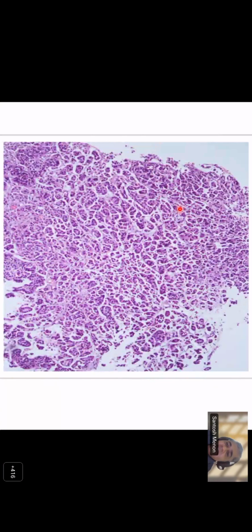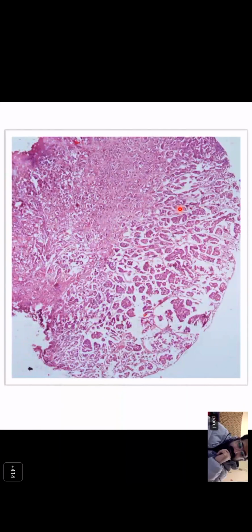Fine. So Jayshree, you want to say more about this? Sir, I could see micropapillary architecture. So you call them micropapillary? How is a papillary different from a micropapillary? Anybody else? Ruchika, you want to? Yeah, sure. I can see a nested pattern. Okay, where there is no fibrovascular core.